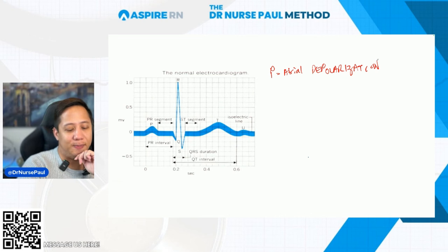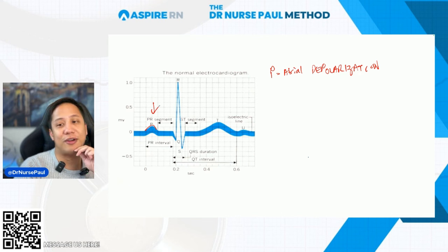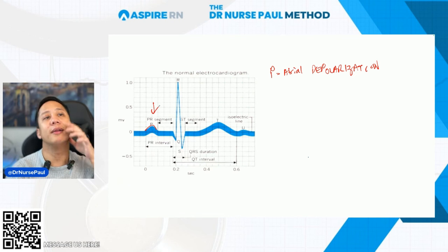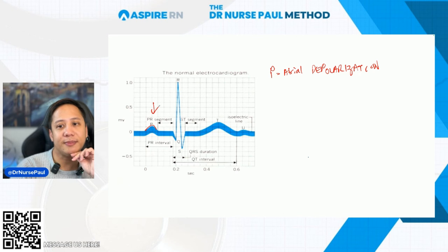You see that little bump? It means the atria contracted, right? Agree? There's a little delay. And guys, for those in the public view, refresh your screen. Come on, refresh your screen. Some of you guys are a little delayed, like literally answering me 2 to 3 minutes later. Some people are still answering SA node, AV node. We've already moved on.